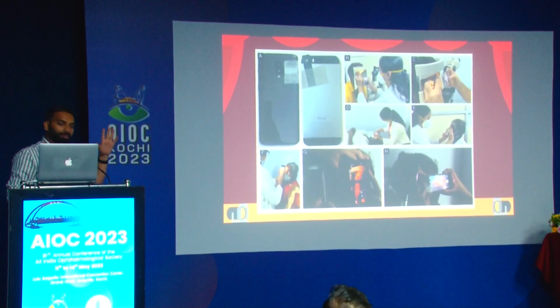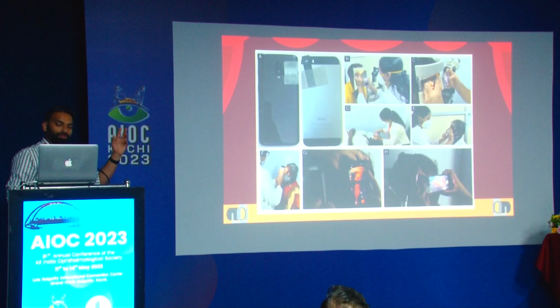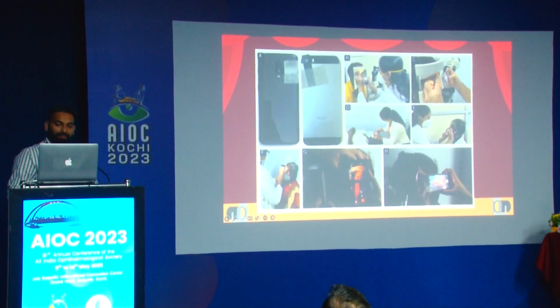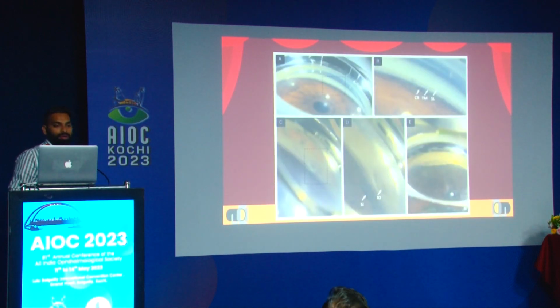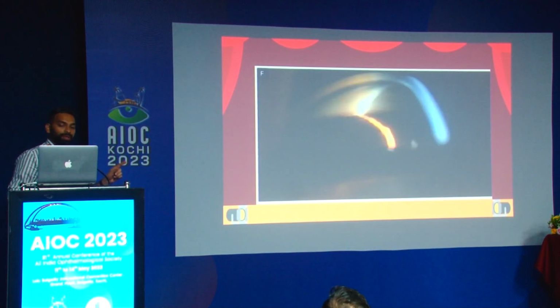We did it by making the patient sit at the slit lamp for stability, or if there is no slit lamp, we did this with the patient just sitting, even lying down. Even with the retinoscopy slit, we use a slit to replicate the way we get images in the normal slit lamp. So these were the images that we got using the ASPI gonio. You can see how clearly you can see these structures, and this was the one which we got using the retinoscopy slit and the ASPI gonio together. But the problem here is we need another person to focus the slit onto the angle.